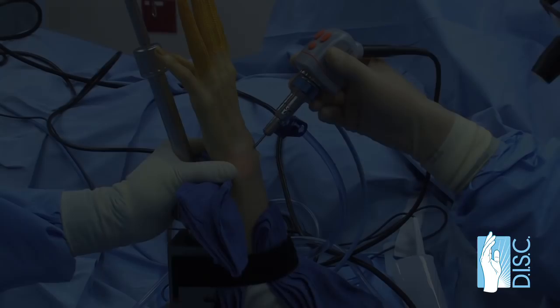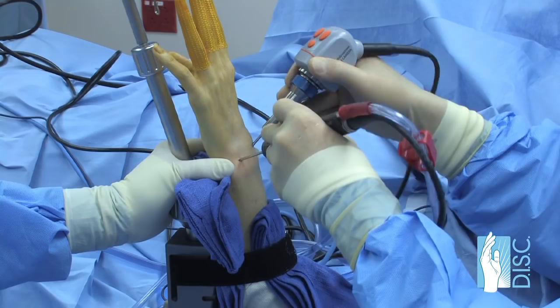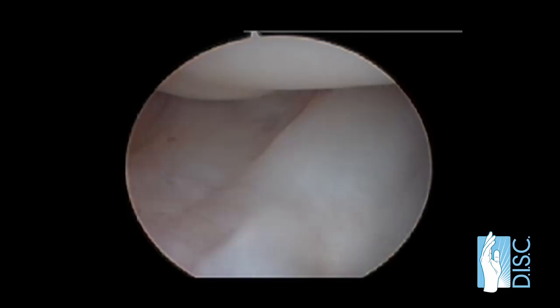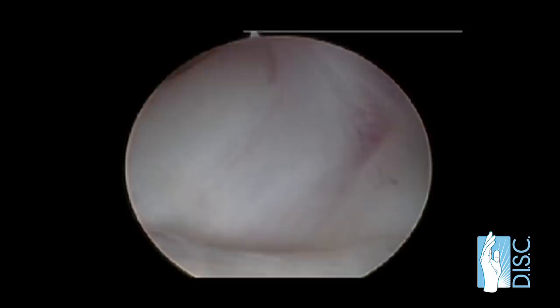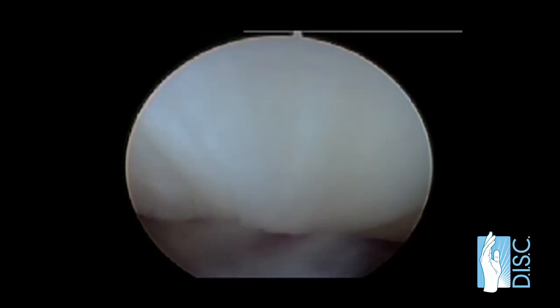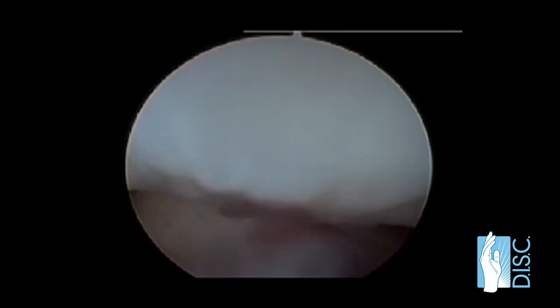Arthroscopic surgery involves triangulation. Here with the arthroscope in my right hand, which allows a video picture, moving instrumentation with the left hand. This shows the main ligaments of the wrist, the extrinsic ligaments on the palmar side or front of the wrist, which are stout ligaments that go from the radius in the 9 o'clock position there to the scaphoid in the 12 o'clock position. This shows the interosseous ligament between the scaphoid and lunate, this kind of fluffy structure that is a very important ligament that holds the two bones together.